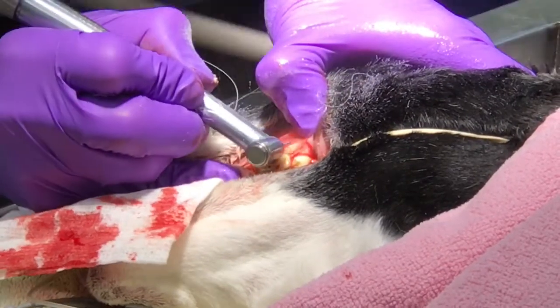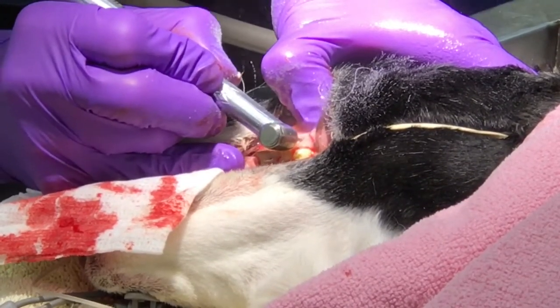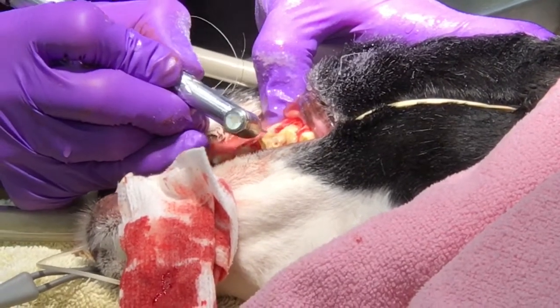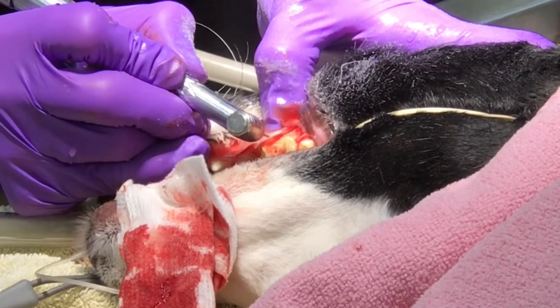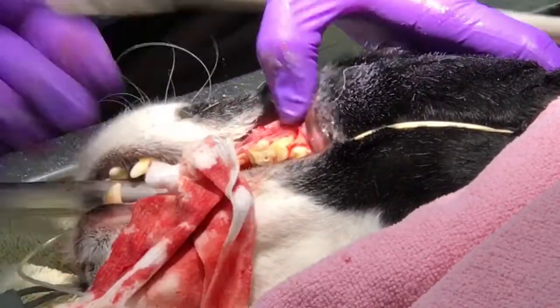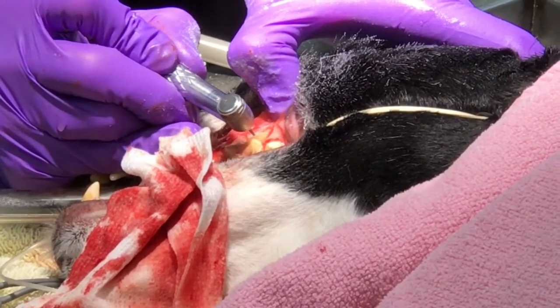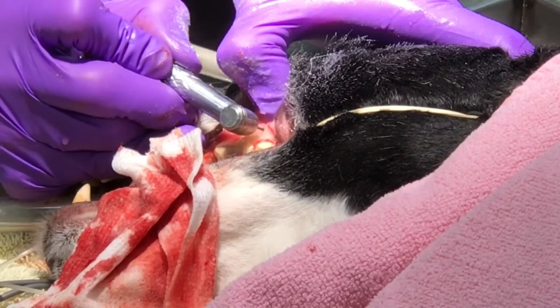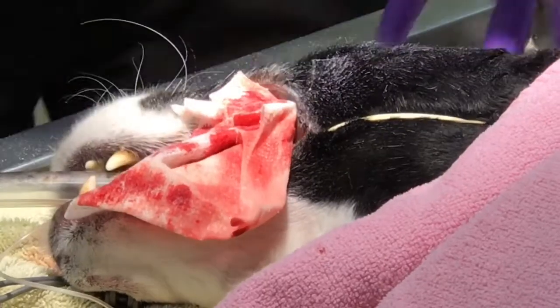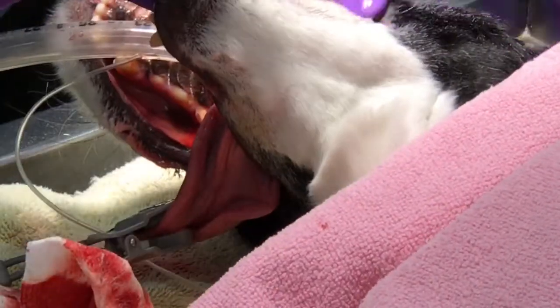And the length of these roots is pretty long relative to what most people think. And we have to be careful because we don't want to bump into a neighbor. Now we've got a little bit more of this exposed. So now we're going to section the tooth into 3 segments. Alright, so now we're going to attempt to section this.